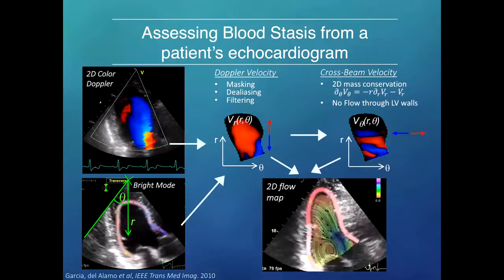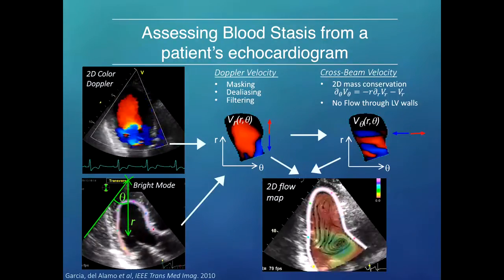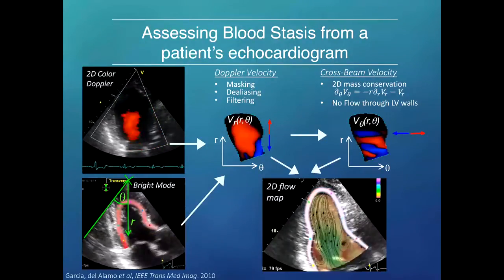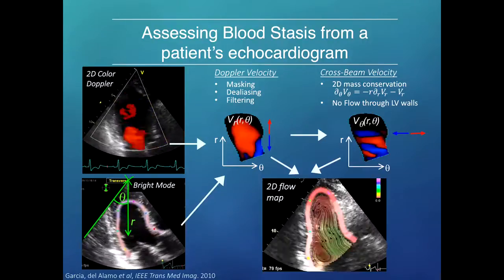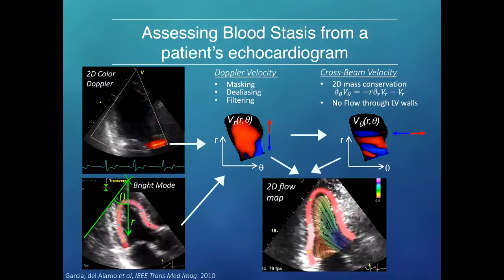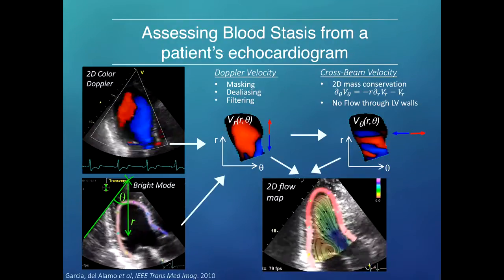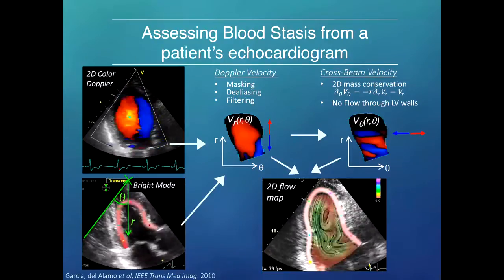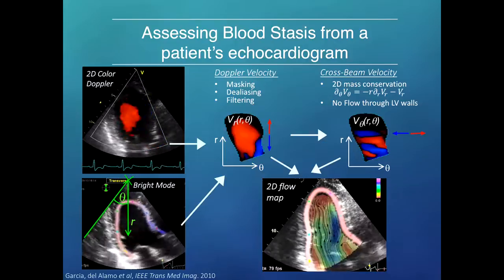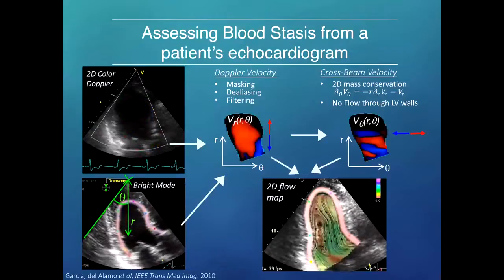So what you see here in black are these lines that are parallel to the two-dimensional velocity field in this plane at each instant of time. And with color, you see the magnitude of the velocity. Things that are red are essentially non-moving. And as you go up this color scale from yellowish to green, blue, and magenta, the speed increases. For those of you who are curious, this is actually my heart, which tells you how non-invasive this technique is, that we can actually try it on ourselves as many times as we want.